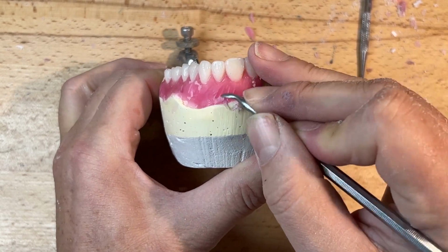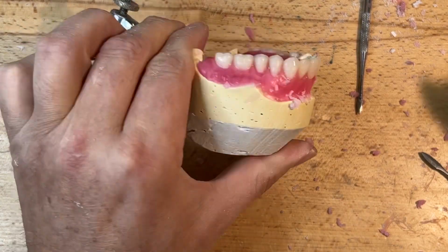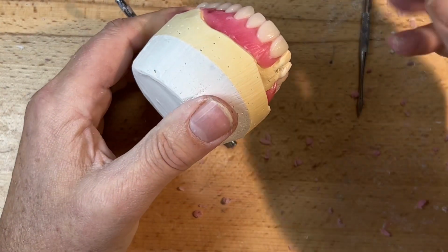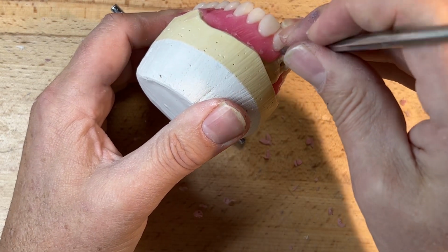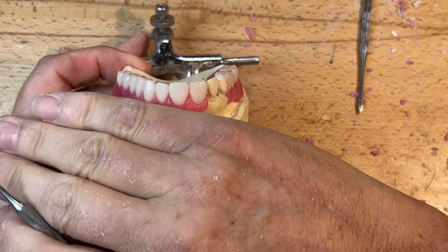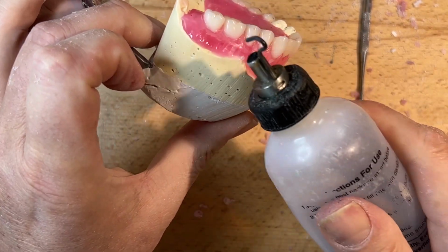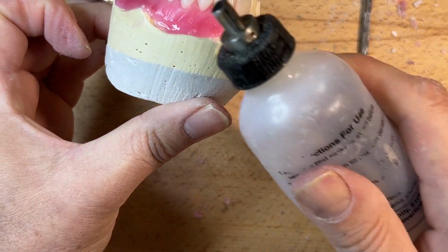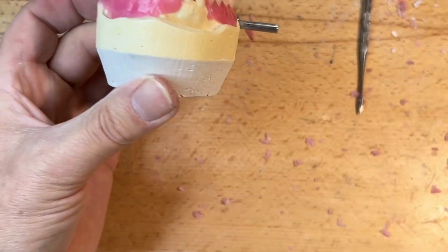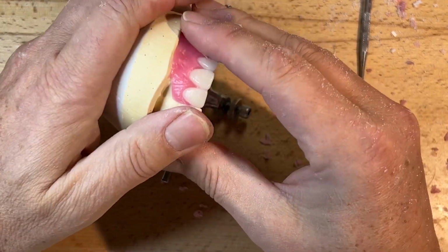Again, this is a really basic wax up because like I said, if there's any changes, this will all be for naught. You take a little brush, take a little bit of the leftover wax off. Got some definition. Looking at the length of the gingival margins. I'm going to go back with an alcohol torch and maybe smooth out some of your festooning without ruining the gingival margins, please. We'll keep some basic anatomical structures. Oh, beautiful.